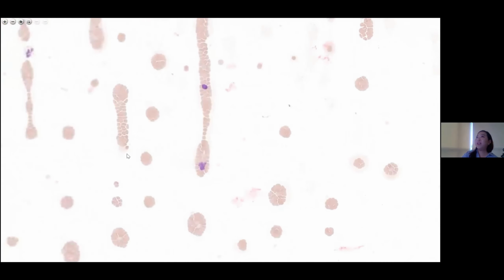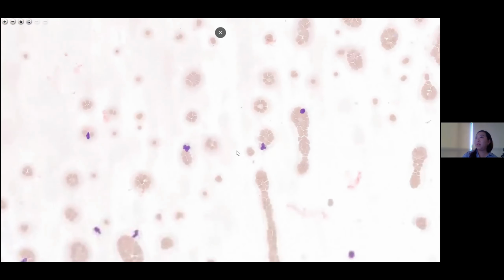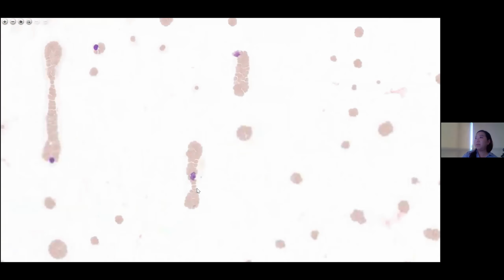Sorry, I'm just looking for a good field here. There you go. There's some more white cells. All right, this is better now.